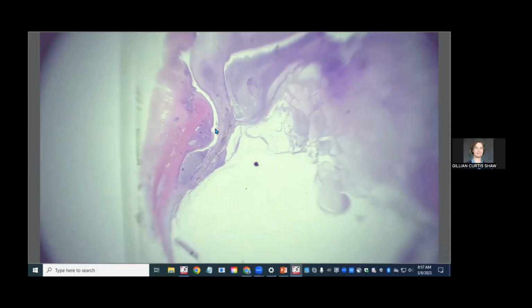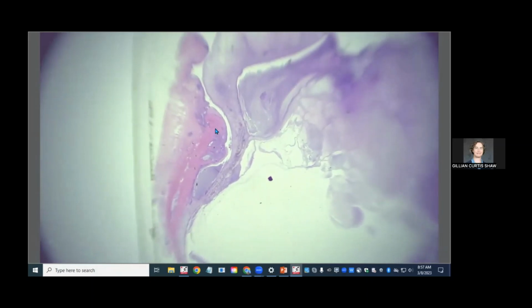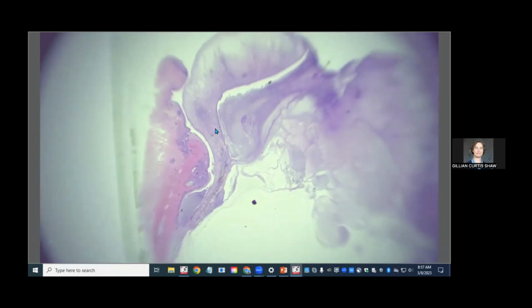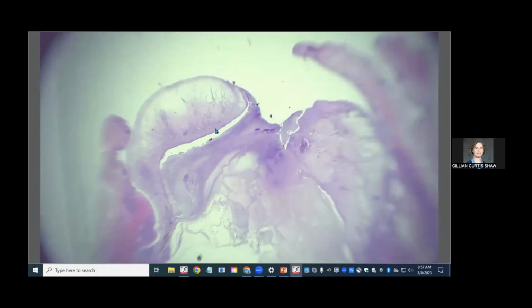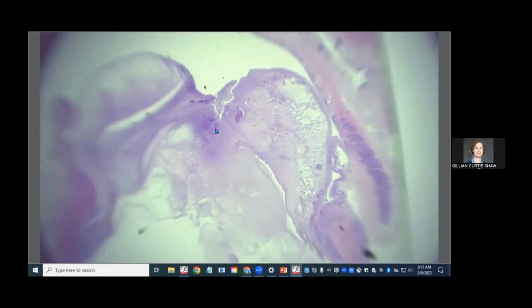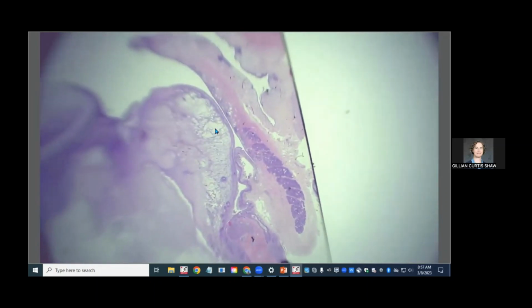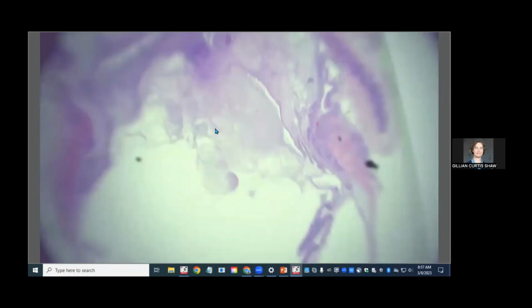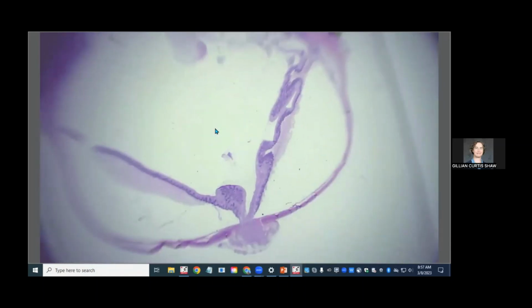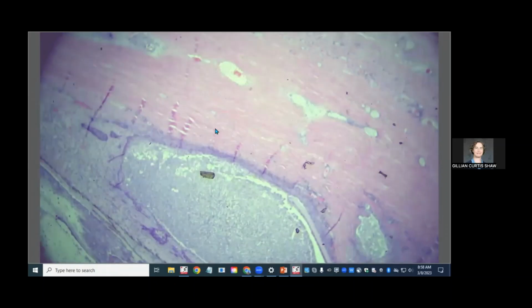And then this limbal area is expanded by purple, which usually means cells. And then there's also this lining of purple that wraps around the iris, which is maybe difficult to appreciate from this magnification, but it's present on both leaflets. And then we've got all this pus and fibrin in the center and no lens to be seen. The retina is detached, unsurprising, but given our time constraints, we will focus on what is happening at the front of the eye.